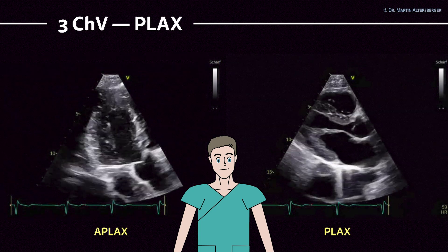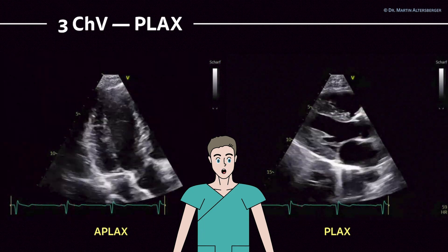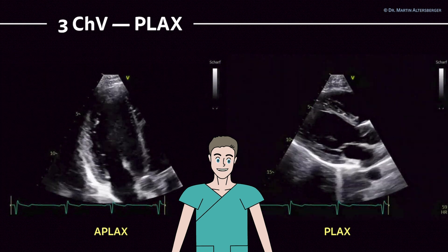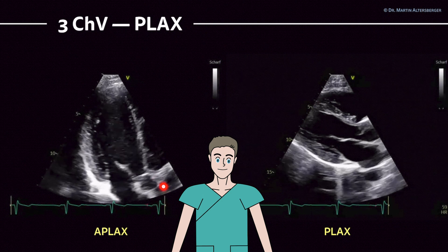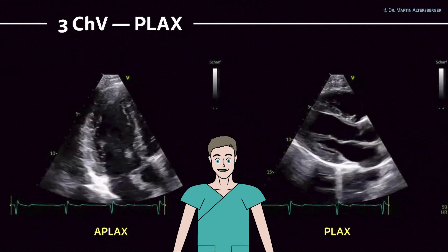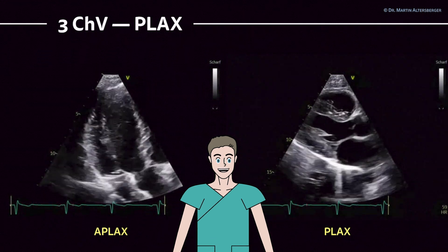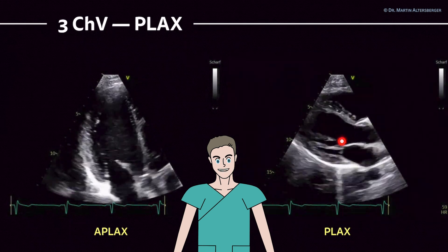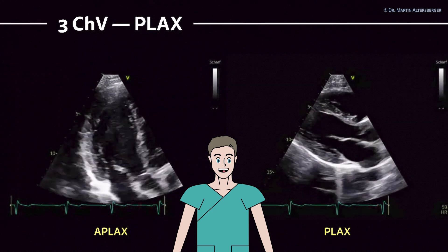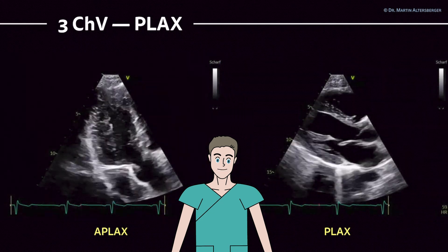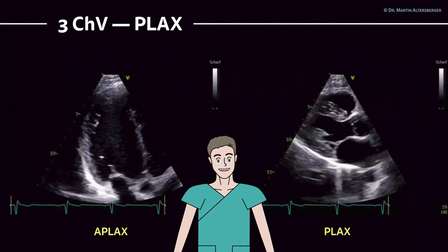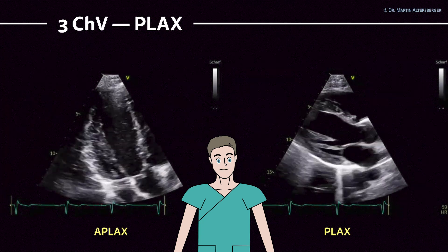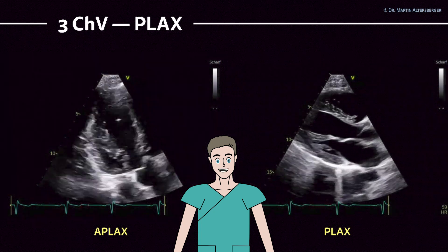The apical long axis view resembles the parasternal long axis. Here you have the apical long axis with the mitral valve — the anterior and posterior mitral valve leaflets — the aortic valve, ascending aorta, the right ventricle, parts of the tricuspid valve, the left ventricle, and the left atrium. The same structures are visualized in both views, just with different angulation and focus.